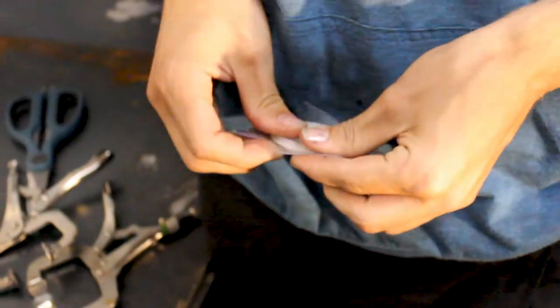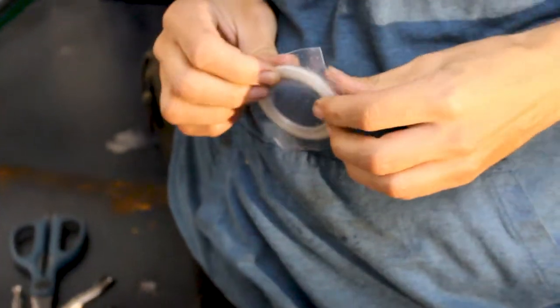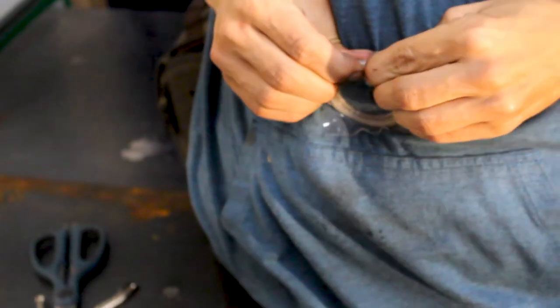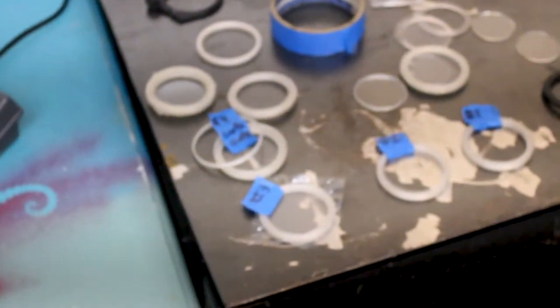It's going. So you invented this yourself? Yep. Yeah, I just designed this in CAD earlier today. Or this version of it. This has been like a week's worth of revisions and stuff.